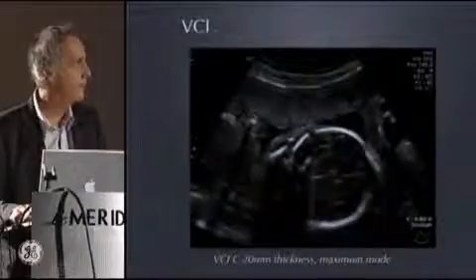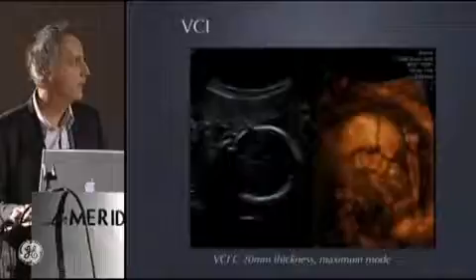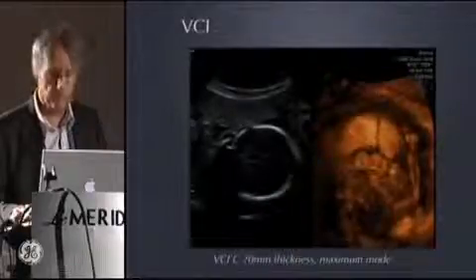Here again with the head. This is a side view of the head. You put the line and you obtain all the skull's bones.